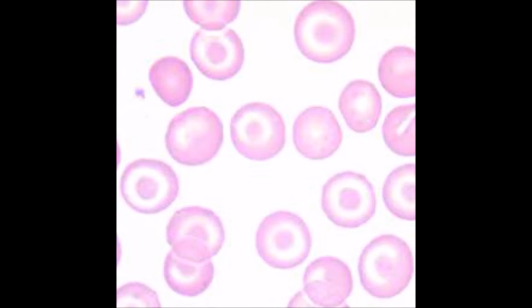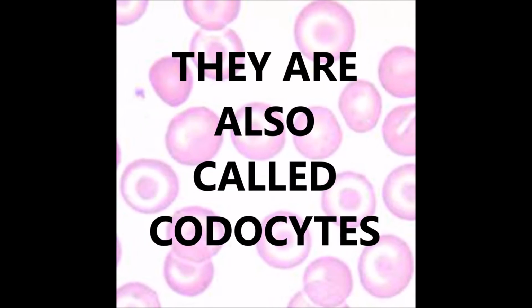And essentially, because of that lack of hemoglobin, structurally these cells are a little more fragile, and what happens is they cave in and flop over into each other, so they assume this sort of bell shape, which is why the central pallor in the middle is more like a ring of white than really an actual central pallor like a normal erythrocyte. And they're usually microcytic, sometimes not, but the main take-home message is that you're going to see a cell that looks like a target. Think of the target logo. That's essentially what a codocyte looks like.